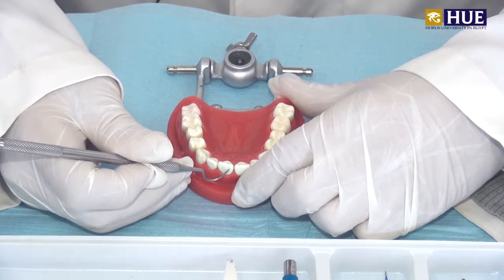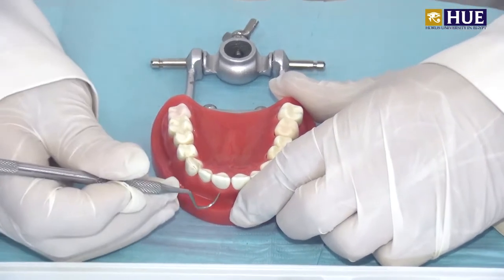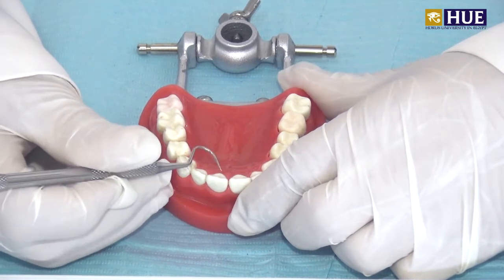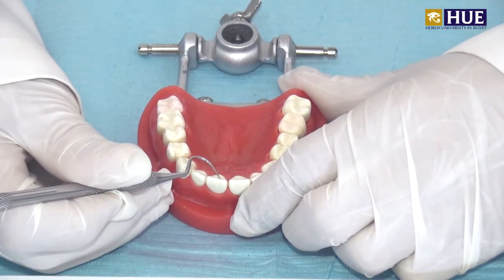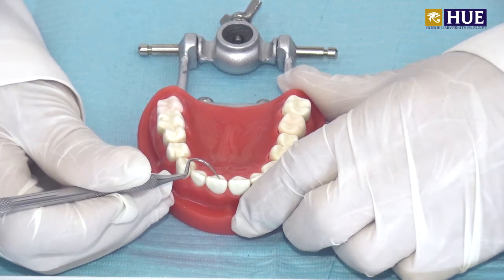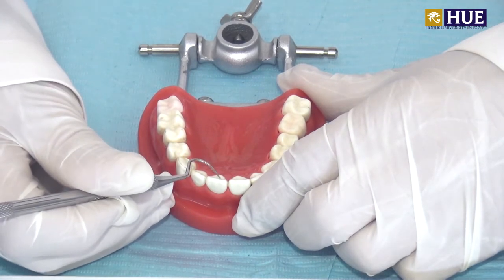provisionalization and some other reasons to start from the labial approach. In the palatal approach, we have three types of class 3 cavity designs. Number one is the GV Black conventional cavity, design two is a beveled conventional cavity, and the last one is a modified design cavity.